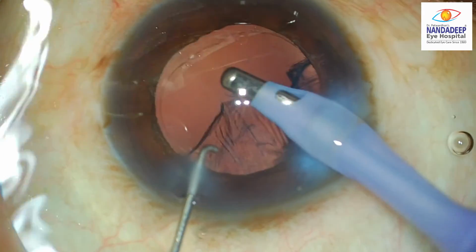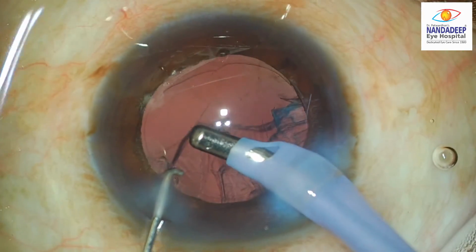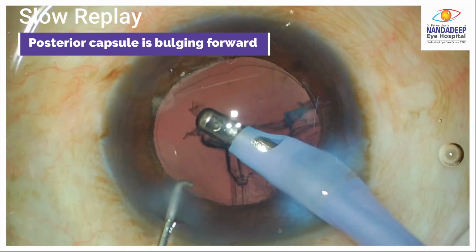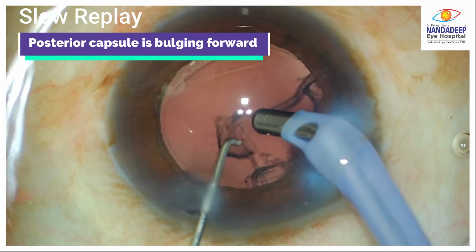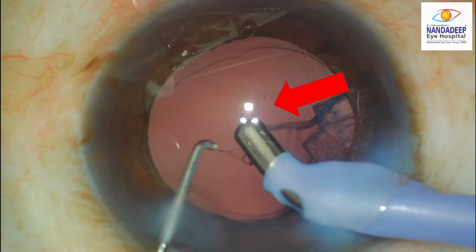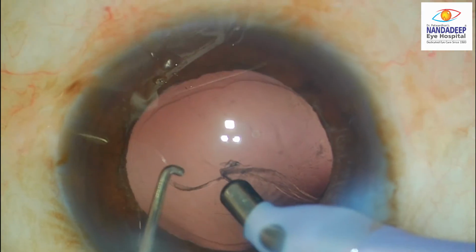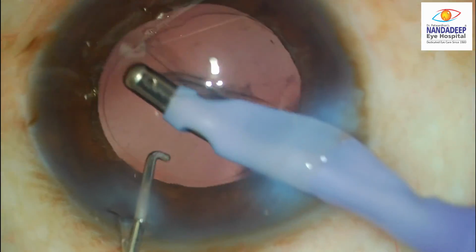During cortex aspiration as well, more redundancy of the posterior capsule was found, and a few debris were also seen floating in the retrolenticular space. As you notice here, while doing cortex aspiration, you could see the lines on the posterior capsule indicating the anterior bulge. We can also see tiny debris in the retrolenticular space. And the surgeon has to be extra careful not to catch hold of the posterior capsule by mistake.